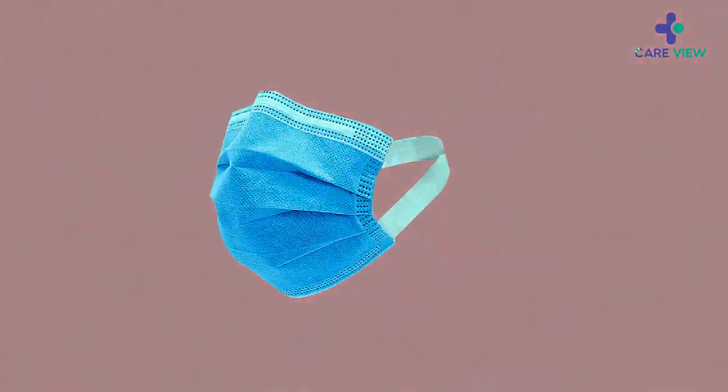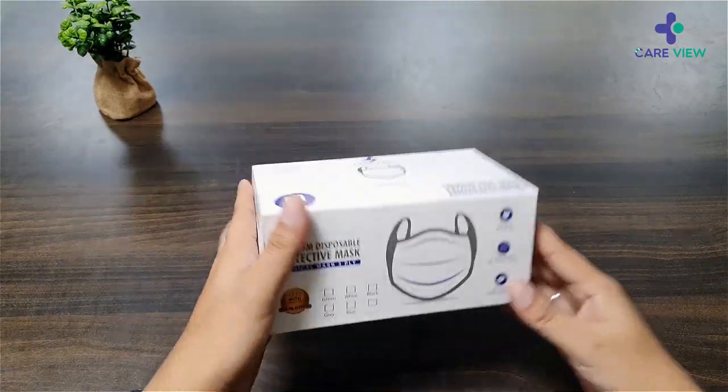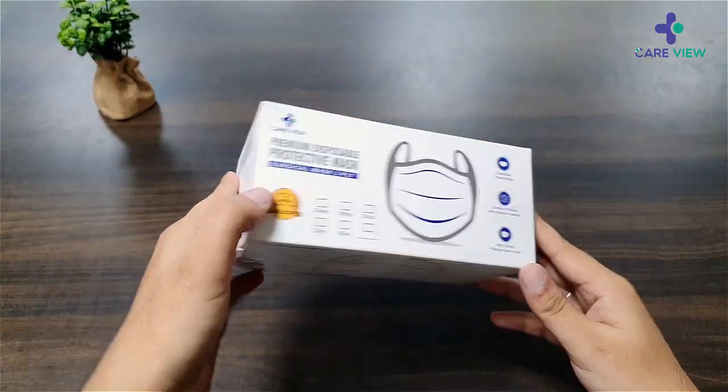Hey guys, this is Aditya. Today we have this three-ply mask from CareView, and I got this from Amazon.com. Let's just see what's inside.